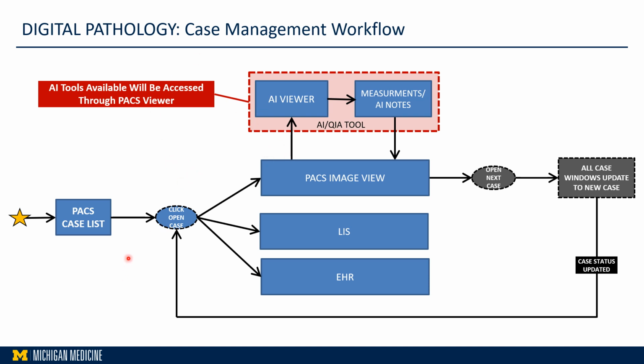And I would like to share with you the case management workflow, which is technically the ideal workflow when the images are assembled in this PACS platform and the pathologists start reviewing those cases digitally, clicking on every single case, opening multiple windows to review the image as well as trying to type the report.